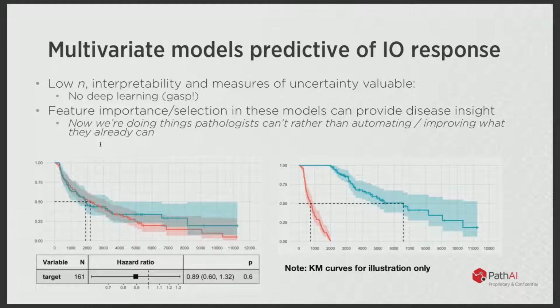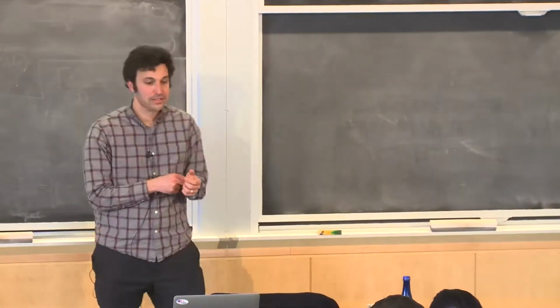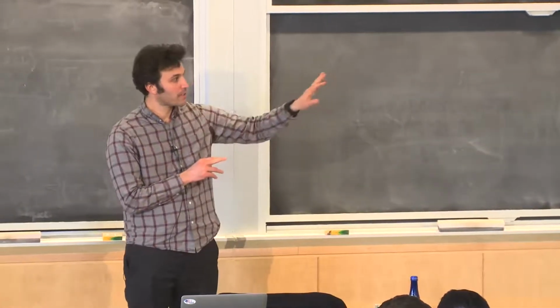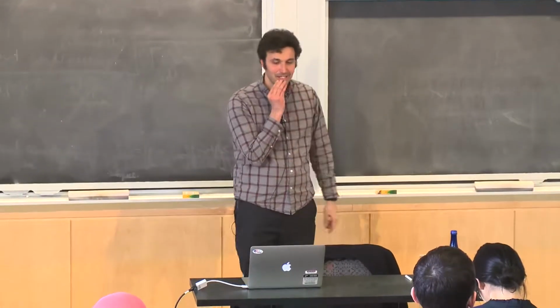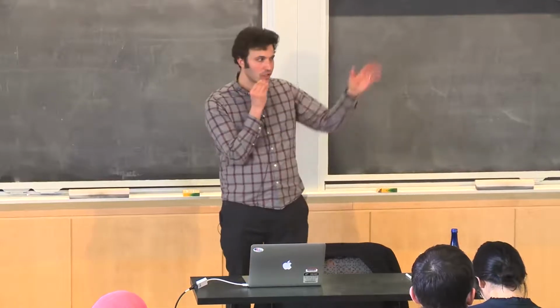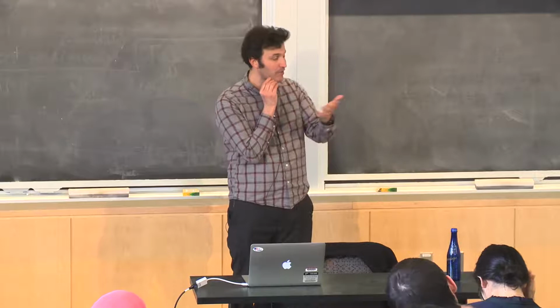Whereas the one on the left, we're saying you don't benefit from the drug, and they truly don't benefit from the drug. So this is the way of using an output of a model to predict drug response, and then visualizing whether it actually works. It's kind of like the example I talked about before, but here's a real version of it. And you can learn this directly using machine learning to try to find patients who actually benefit the most from a drug.